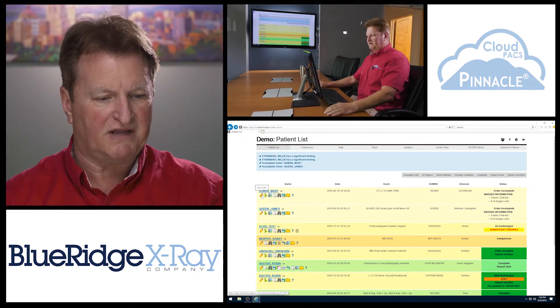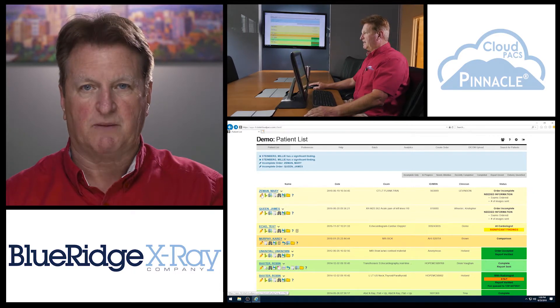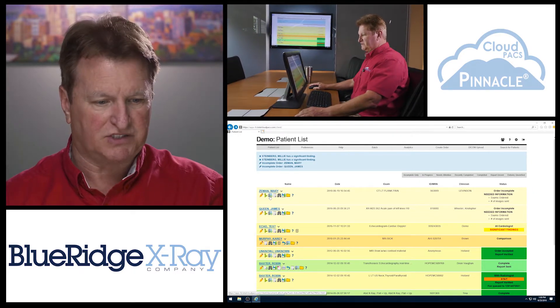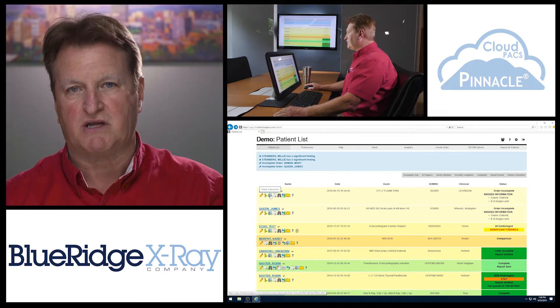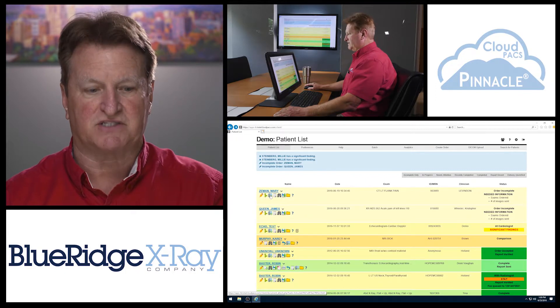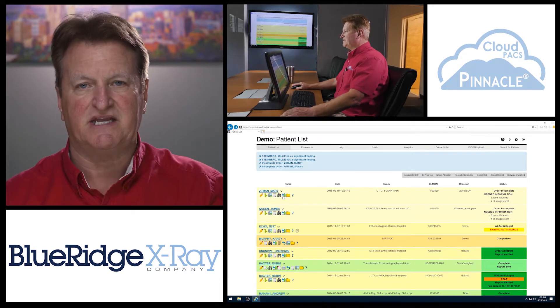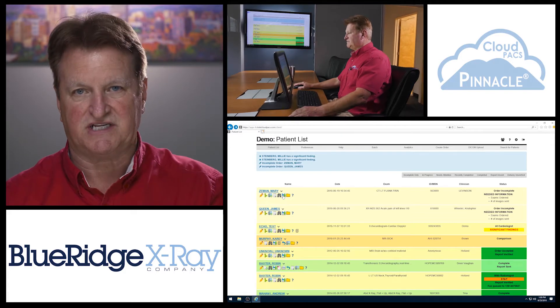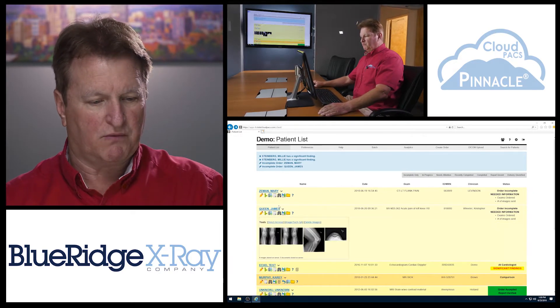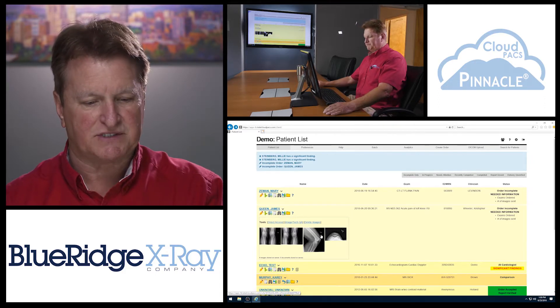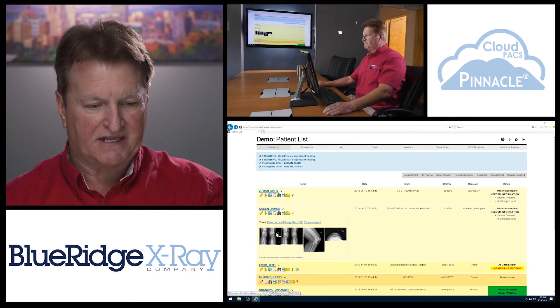The viewer is very simple and very powerful. You can edit the patient's information, merge like studies for pathology comparison, and attach documents such as insurance information or patient reports to the image file. There's an icon to download images from the viewer to a CD, and you can burn CDs from any device connected to a CD burner. The image viewer is the binoculars icon — with one click, it automatically opens the thumbnails of available images and downloads them to the GUI so they can be manipulated immediately.